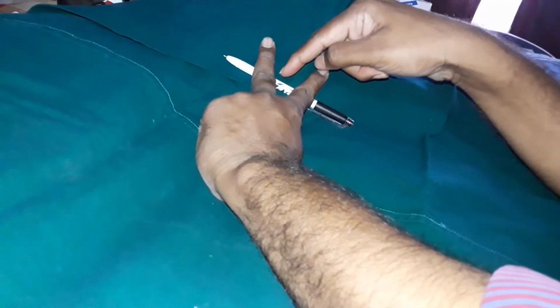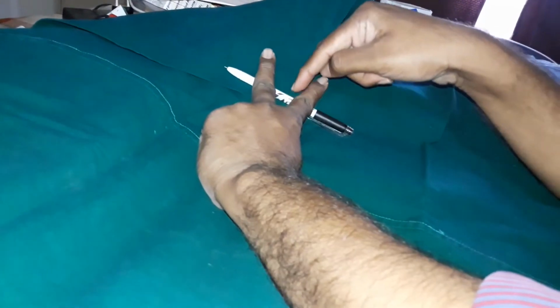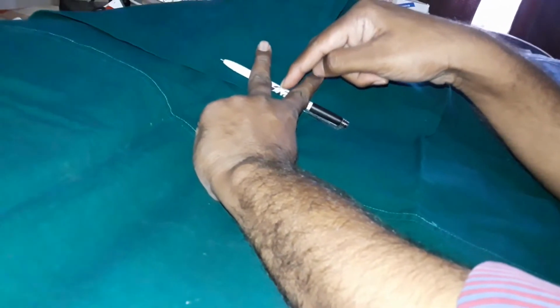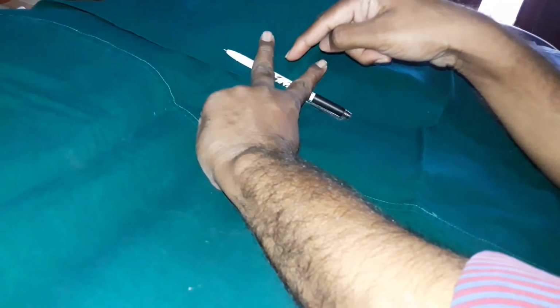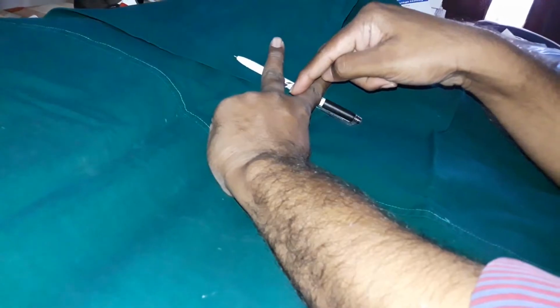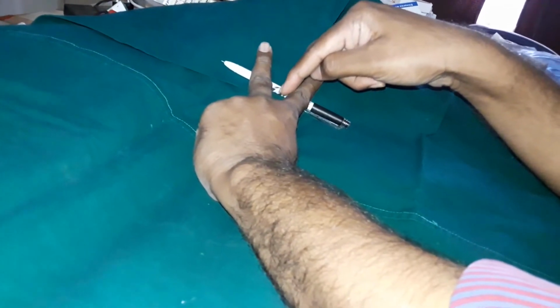When you are coming caudally, the facial recess space is reduced. The point I want to stress is that when you are coming down, trying to identify the round window, there is a potential chance of injuring the facial nerve here.